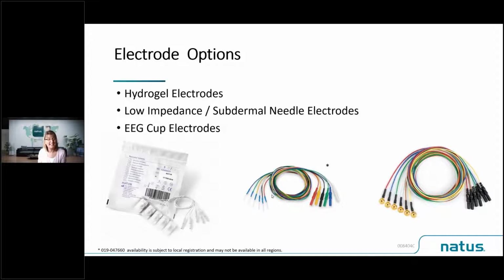These are a 27 gauge needle. They're inserted subdermally. Again, we're going to show some video footage of this. We're going to do some very practical application as we move through. In terms of preparation for needles, these really require preparation similar to what you would do for a blood draw or an IV insertion. So you would clean the skin in an aseptic manner.